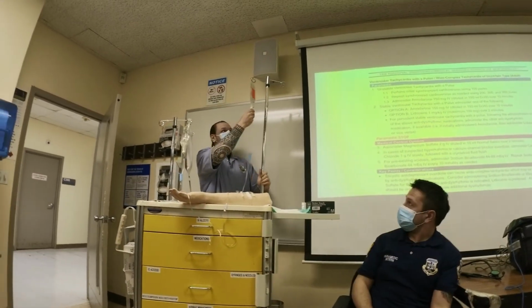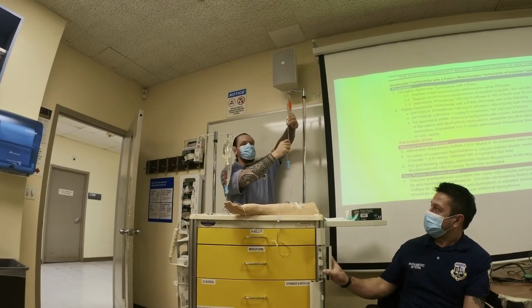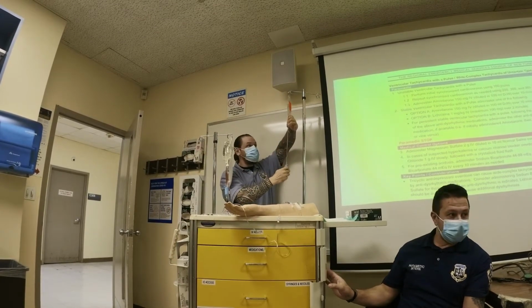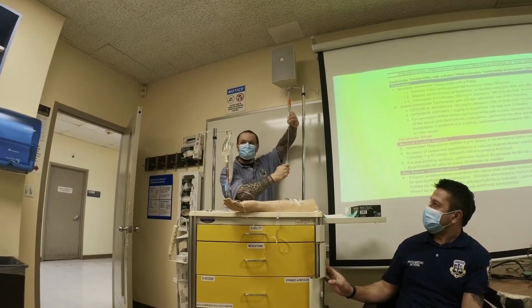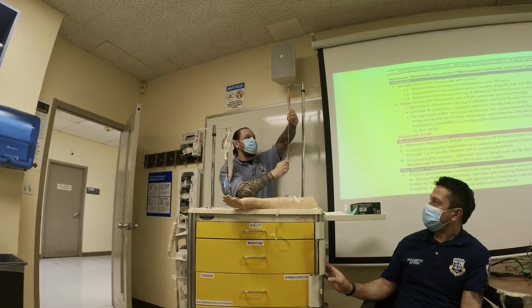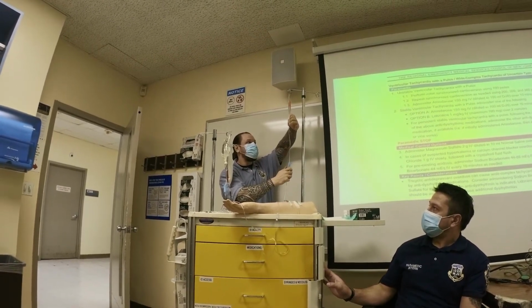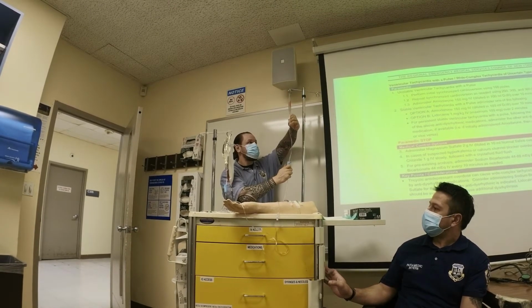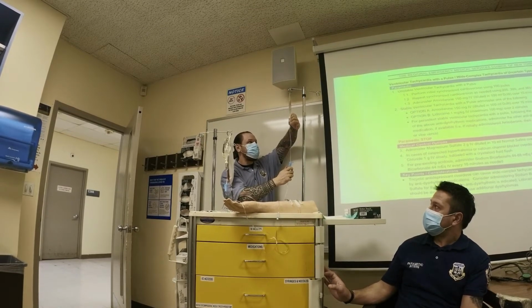When you're counting these drops, put your hand like this, so it gives you a contrast for the drops. And then I slowly let this out, and we said if I did 1.66 every second times 3, we have 5 drops every 3 seconds. So I slowly open this up. I don't flood it wide open. And then I have to see that I get the correct amount. So 5 drops every 3 seconds.